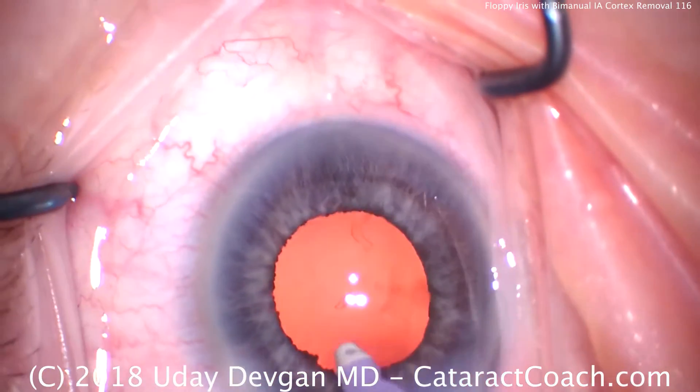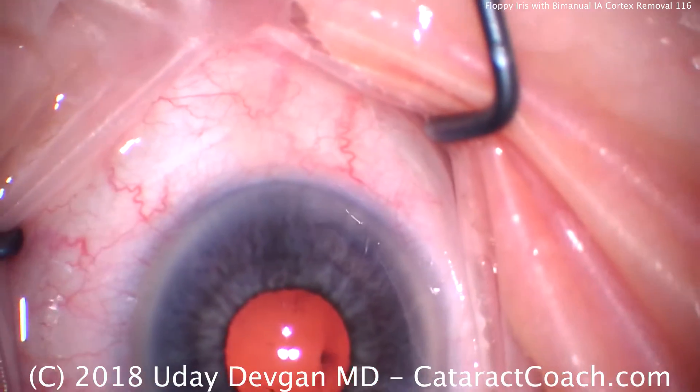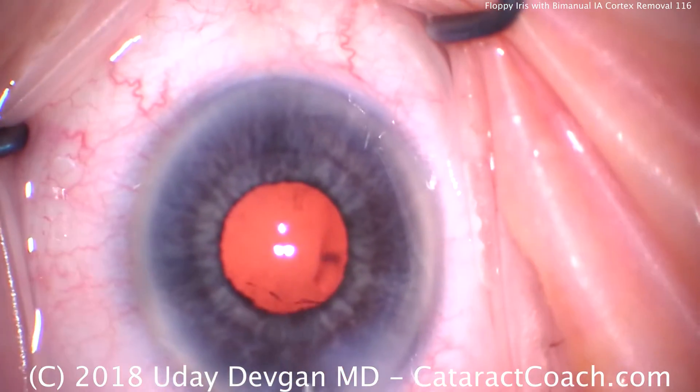I've now put it back together as a coaxial IA to get the remainder that would be difficult to access through the paracentesis. You could make an additional paracentesis incision 180 degrees apart and go from there, but this works just fine. It looks like we're pretty clean here — time to fill up the capsular bag and load our lens. Notice the mobility of this iris, how floppy it is.